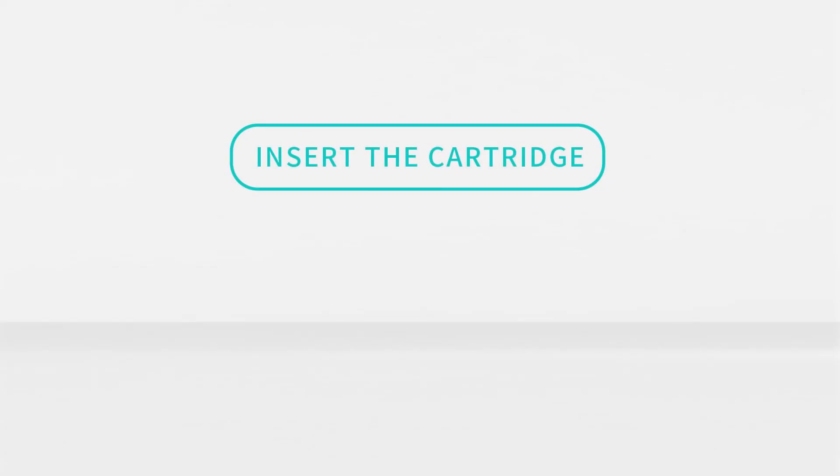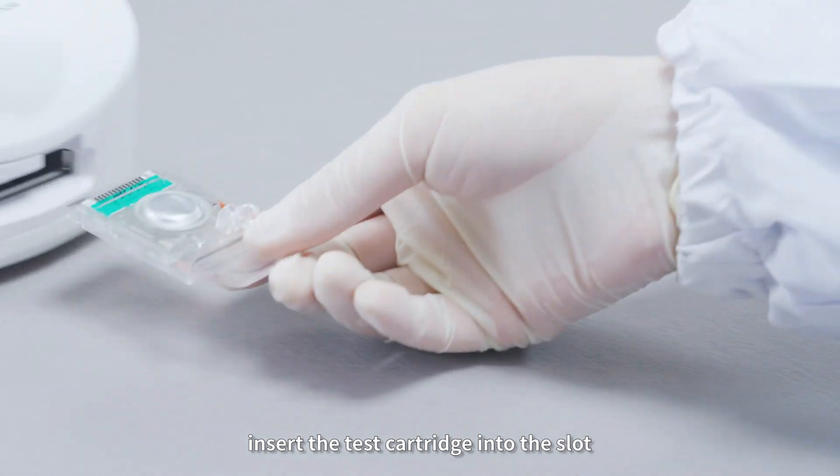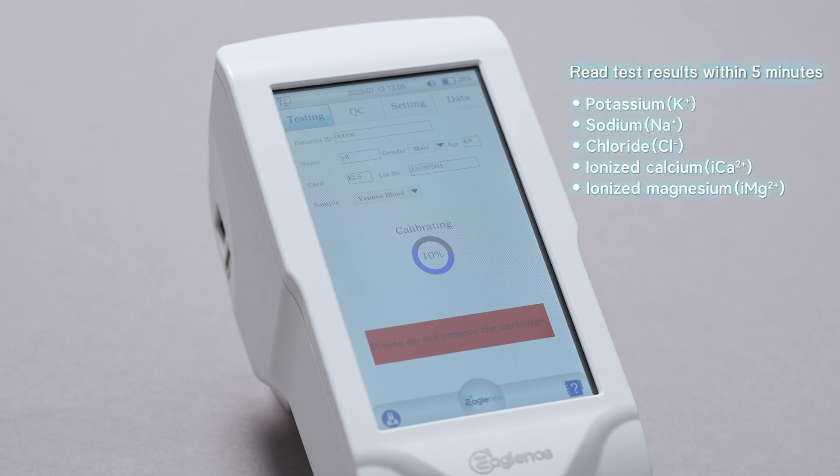Step 4: Insert the cartridge. Insert the test cartridge into the slot. The test will start automatically. Read test results within 5 minutes.